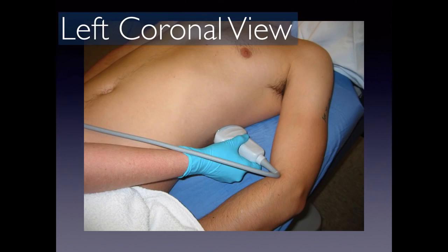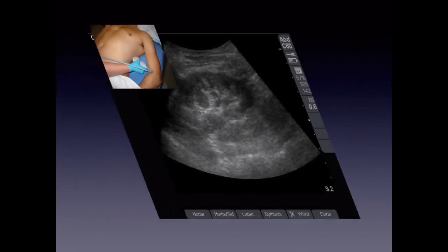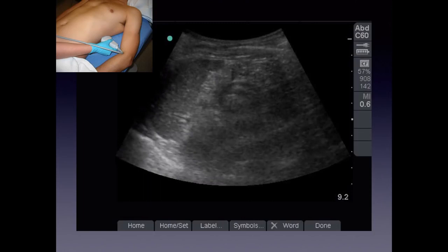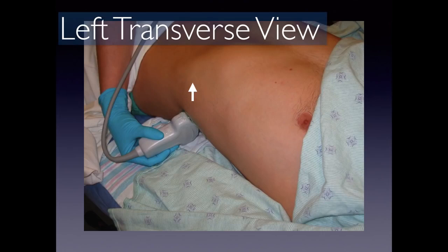On the left side, the technique is very similar. The indicator is towards the patient's head for the coronal view, and the probe is slightly oblique to get the most longitudinal view of the kidney. On this side you see the spleen rather than the liver. For the transverse view, the indicator is up towards the ceiling.